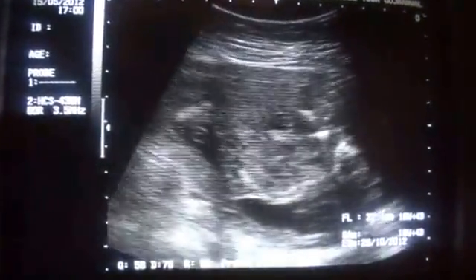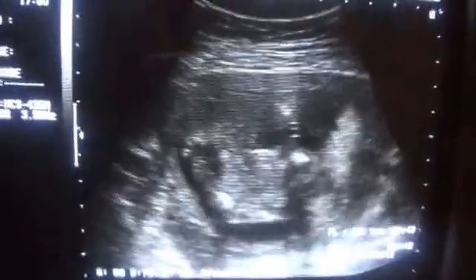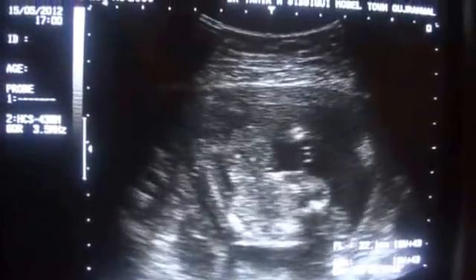This is the transverse. I am trying to get the transverse of the fetus. The benefit of that is that any abdominal defect, anterior abdominal defect, comes in view. And there you are seeing one.